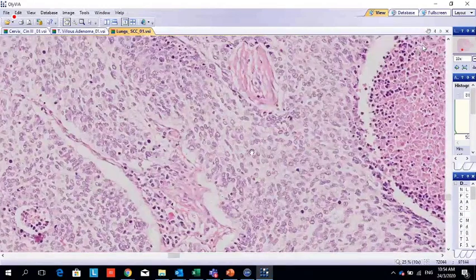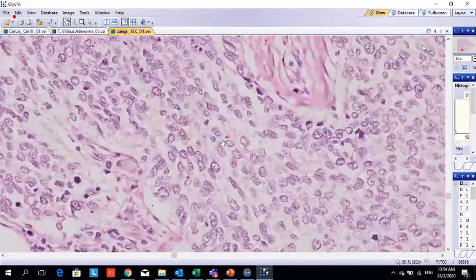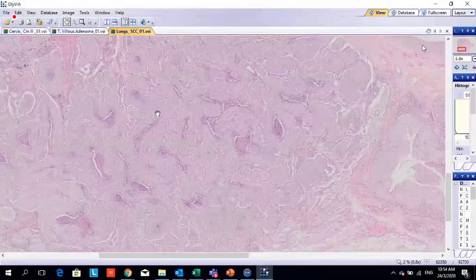Is the alveoli lined by squamous? Bronchus. We said the tumor is in the bronchus, actually, isn't it? Yes. Okay, in this case, it's difficult to find. Usually we say squamous cell carcinoma. In squamous cell carcinoma, how do we know? By the presence of keratin pearl, isn't it? Can you see abundant keratin pearl here?